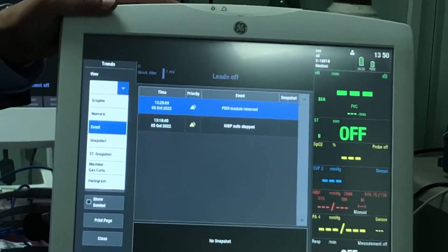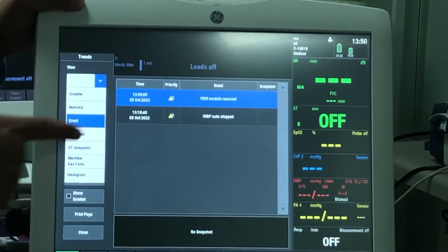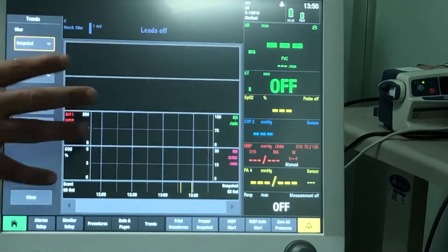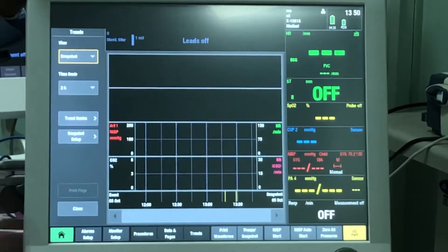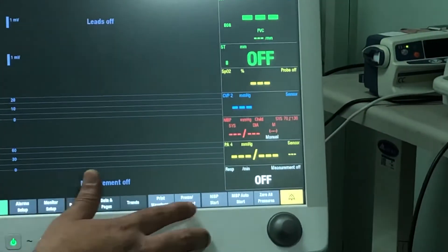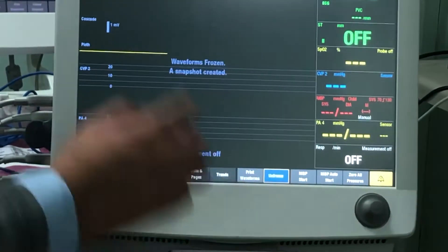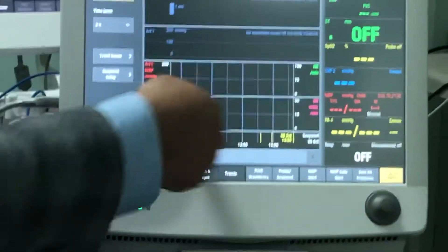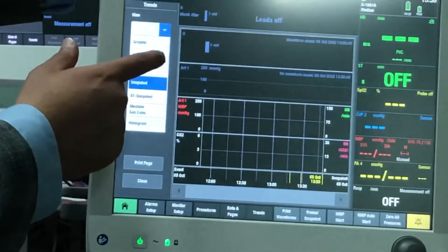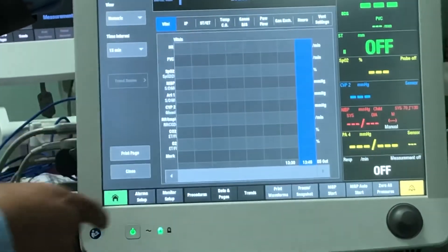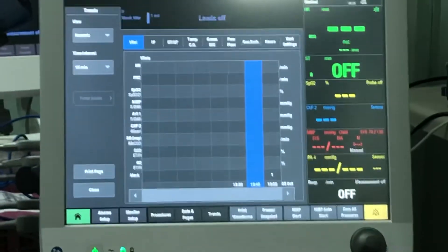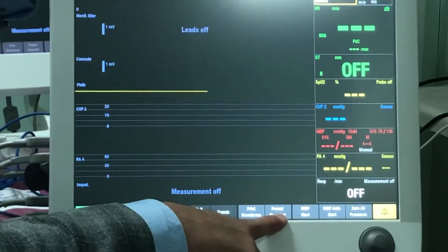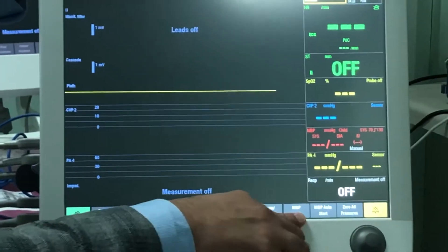Snapshots created automatically are saved here in trends, and you can view them under the snapshot tab. For a manual snapshot, press the freeze snapshot button at the bottom — it will freeze the waveform, create a snapshot, save it, and you can view it under trends. You can also print any page on the monitor, or use print waveform to print only the waveform without the numbers.